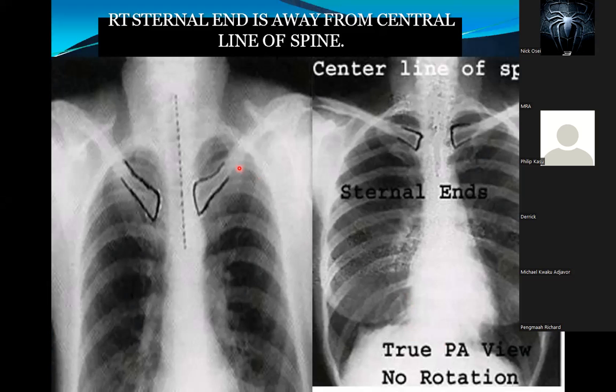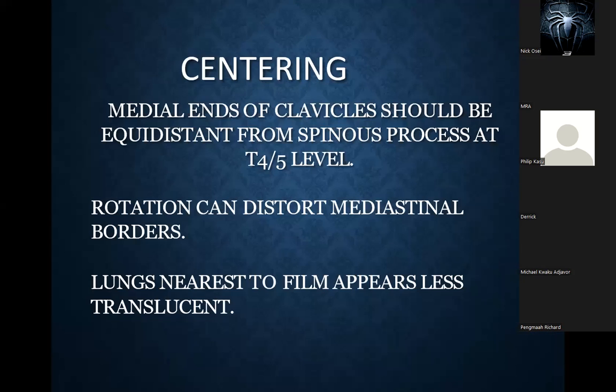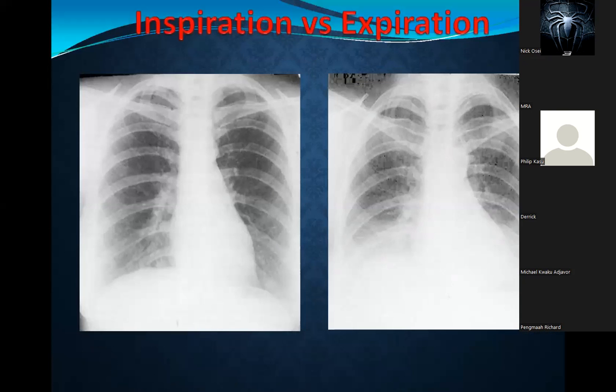Now, when you take the X-ray, you should be able to draw an imaginary line between the spinous processes. I'm talking to anatomy students, so I'm sure you all know what the spinous process is. I think there'll be a better picture somewhere.